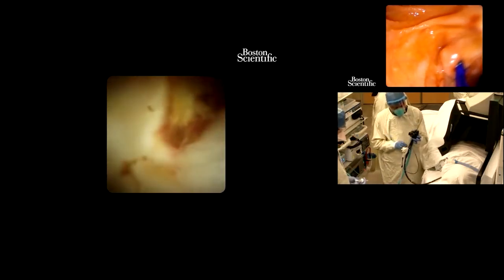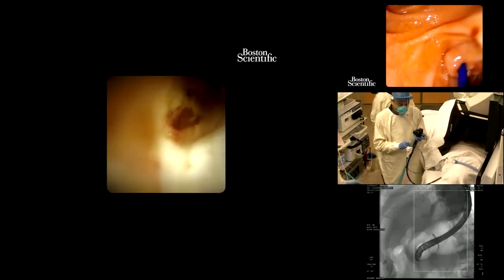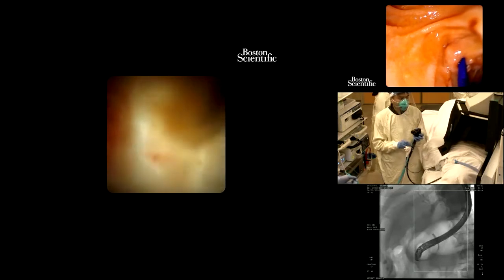So this is a SpyBite Max. Can we open this, Enrique? Let me see if I can leave it here. You can see that the jaws of this, if Steven can focus the camera behind in this black background, you can see that the jaws of this new SpyBite Max are a little serrated. It's larger than what we used to have before. So the expectation is this will provide more tissue compared to the conventional techniques.